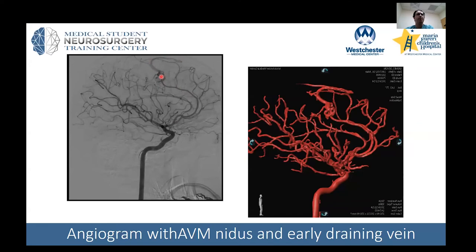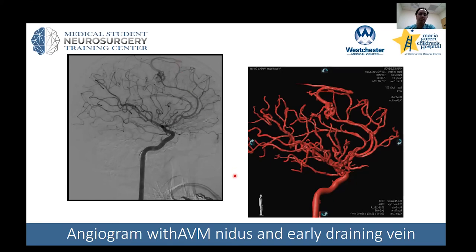An early draining vein is a key feature of an arteriovenous malformation. Normally blood passes through capillaries and we don't see the veins right away, but because there's no intervening capillary bed, the vein lights up much earlier in what's called the arterial phase. This cluster of tangled vessels is called the nidus. Important features to assess include the size of the lesion, the venous drainage, and where it's located — specifically whether it's in eloquent cortex, meaning parts of the brain where injury could cause devastating deficits such as language problems or weakness. This reconstruction shows the tangle of abnormal blood vessels.